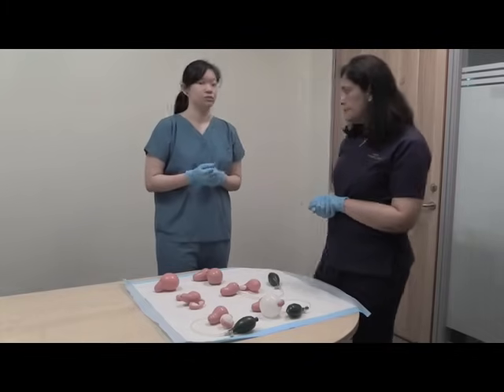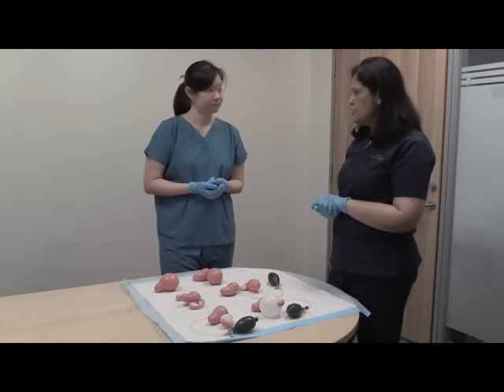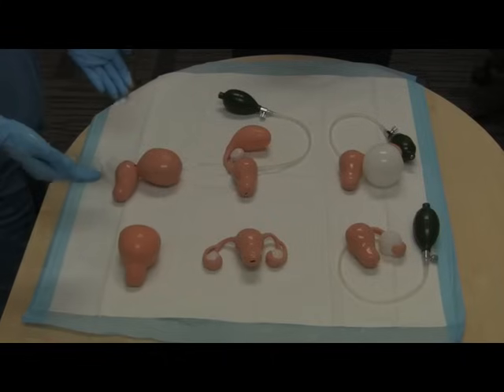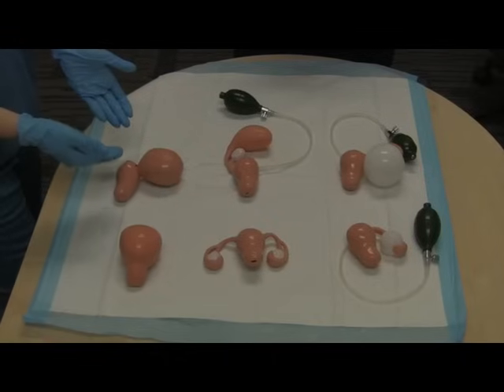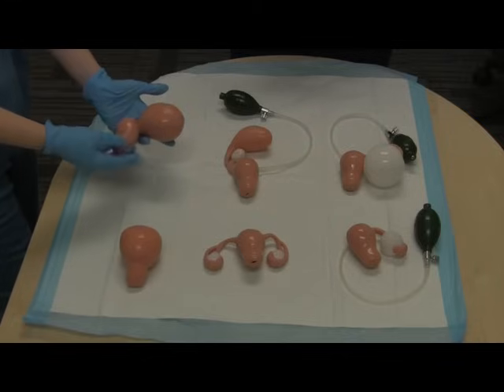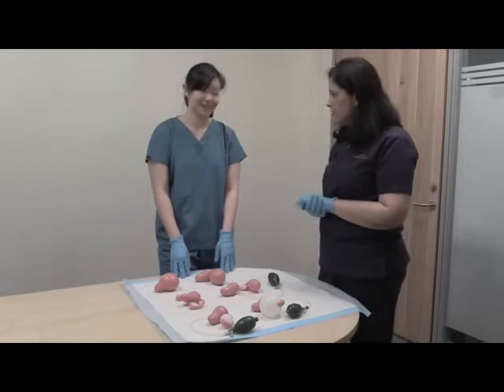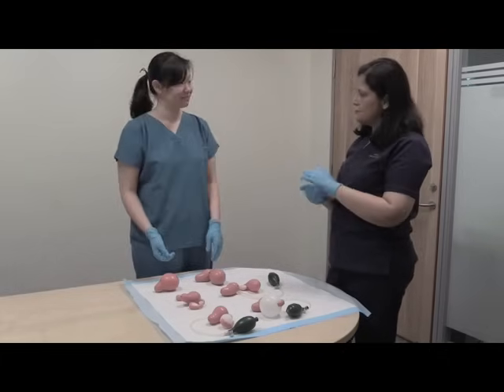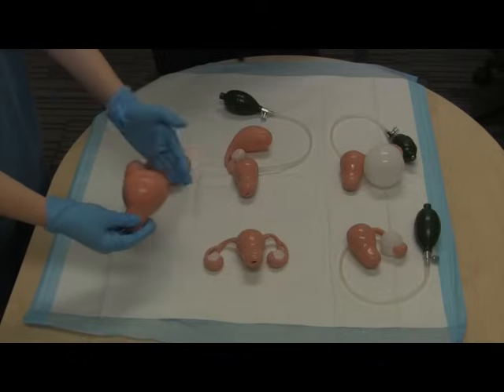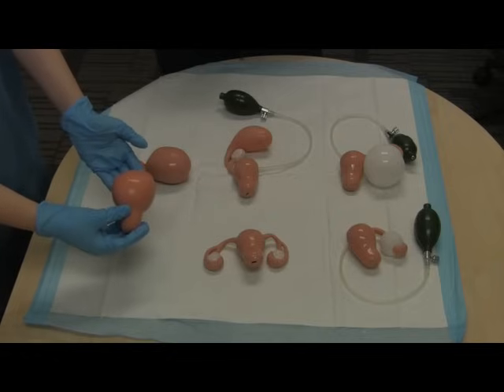Besides the normal uterus, we also need to familiarize ourselves with abnormal or pathological presentations. Some of the models here show this very clearly. In this model there is a large mass growing out of the uterus — most commonly this would be a fibroid, and this appears to be a subserosal one, as you can see it's positioned going towards the outside. In this other model the uterus appears globally enlarged, which is very likely to represent an adenomyotic uterus.